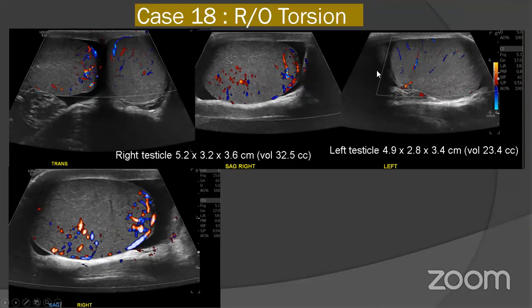And so here the vascularity is uniformly distributed in the left testicle. And here, if you notice, this portion of the testicle has no vascularity. So this patient, no, it's not detorsed because the vascularity is not increased, but it's a little asymmetric. Yeah, I guess because you think this is slightly increased.